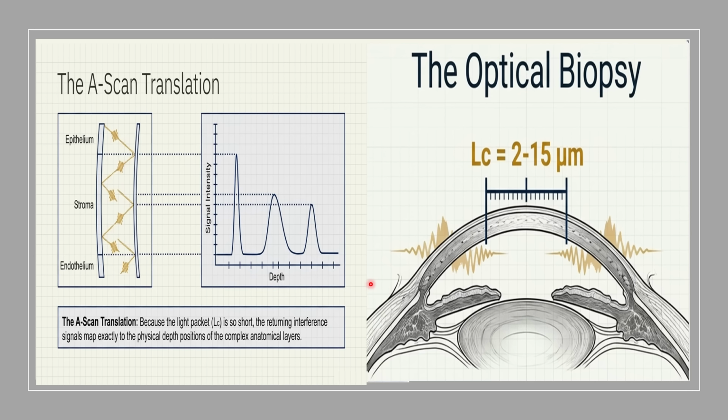The OCT uses a low coherence light. This low coherence, actually, is an advantage. The presence of low coherence, these pulses or bursts, is an advantage, not a disadvantage. Because if you use a standard light with continuous pulses like this, what will happen?